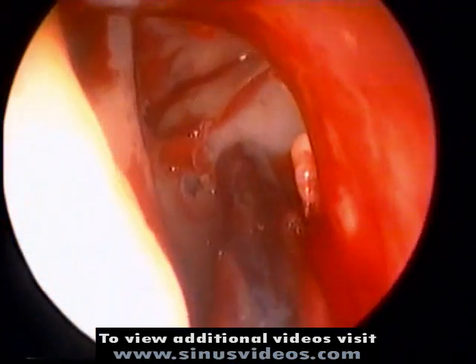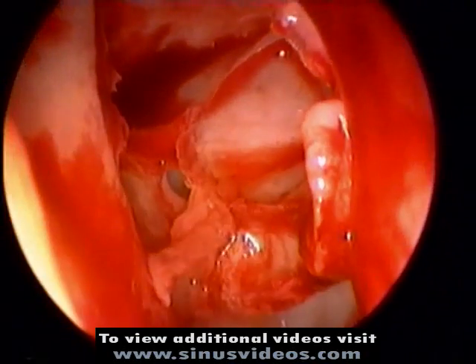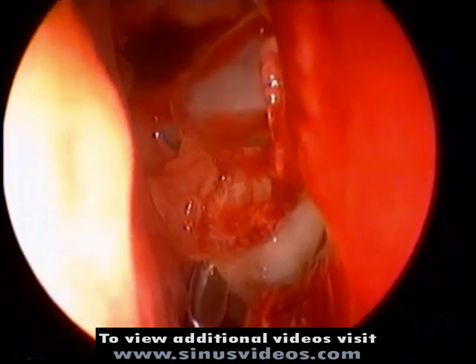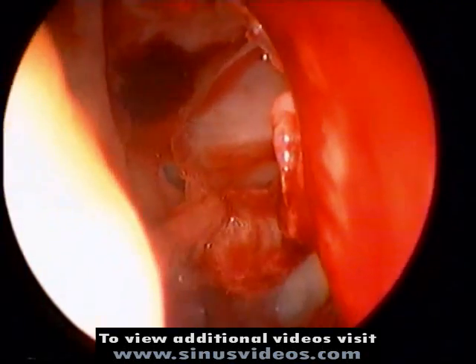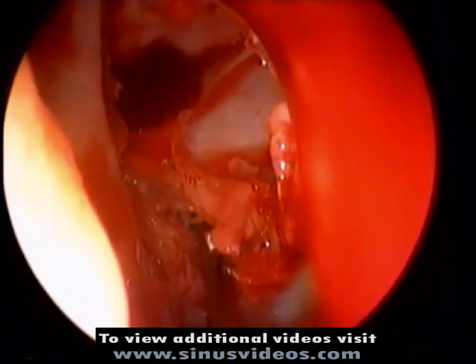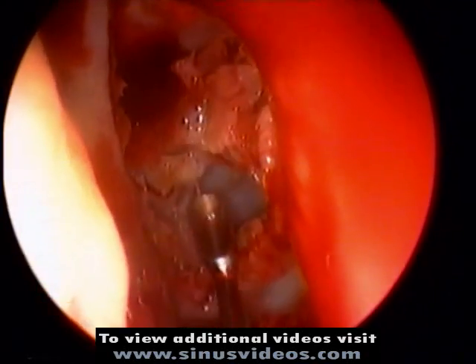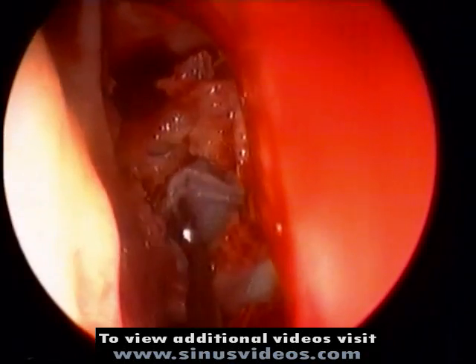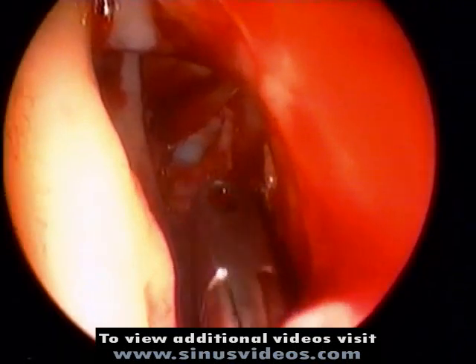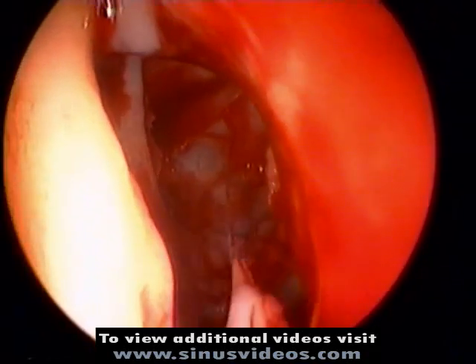The basal lamella is then evident with a small hole shown here. The basal lamella is entered with a small spoon curette at the junction of the vertical and horizontal components. This opening is then enlarged as the vertical portion of the basal lamella is lifted away from the roof, and the posterior ethmoid sinus air cells are exposed. The vertical portion of basal lamella is then grasped with a straight Blakesley forceps and removed.